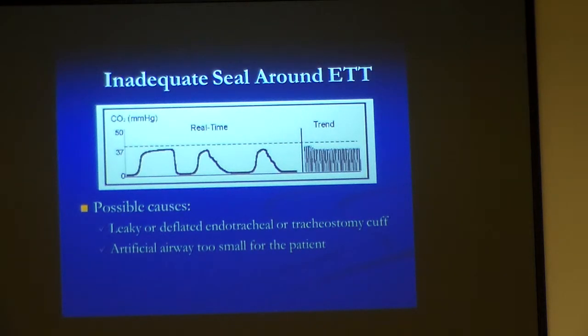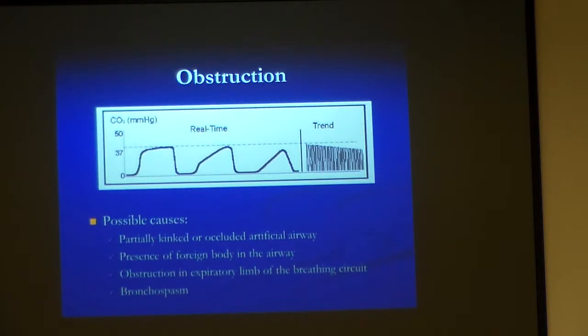When you're in the middle of a code, you're probably not going to be looking at this waveform continuously, but it gives you an idea of what's going on, especially if you've pushed your snapshot and later on you can look at it and go, oh, okay, that's what was going on.